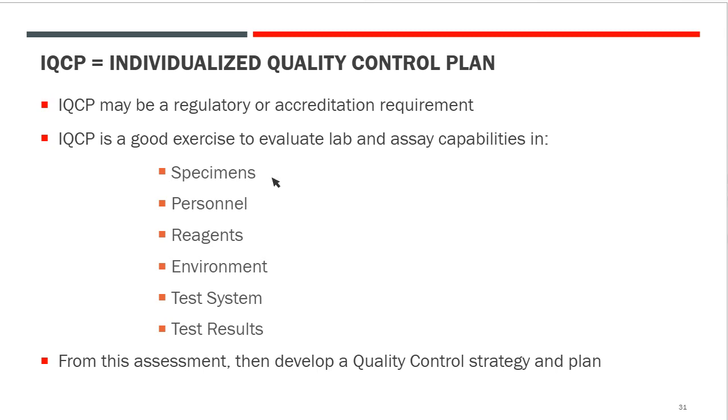What's going on with the specimens? How well are the personnel trained? How do you know that they've been trained well? Do you test them periodically? How well are you storing the reagents? How do you assure that they're in date? What is the environment in the lab? Is there a maximum and minimum temperature, and how do you monitor that? How do you know it's actually being kept there? The same questions about the test system, same questions about test result.